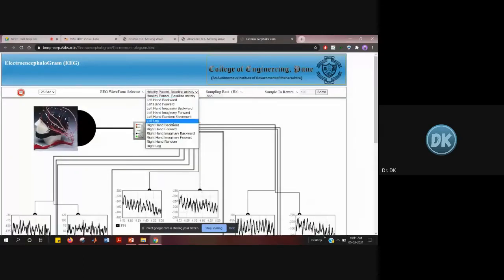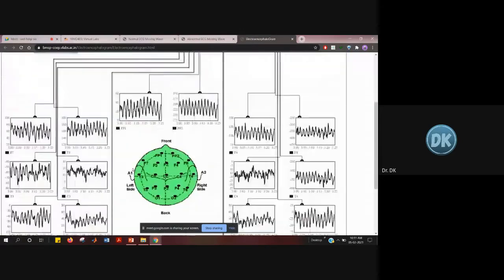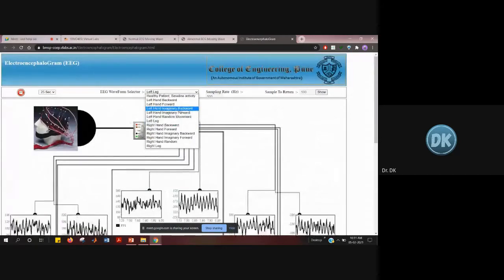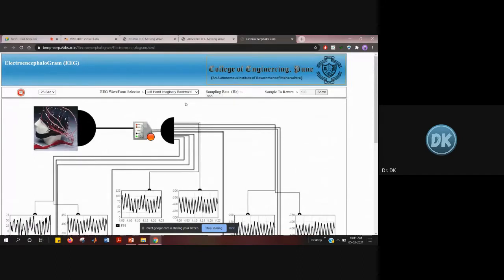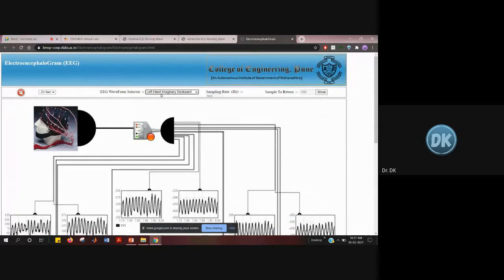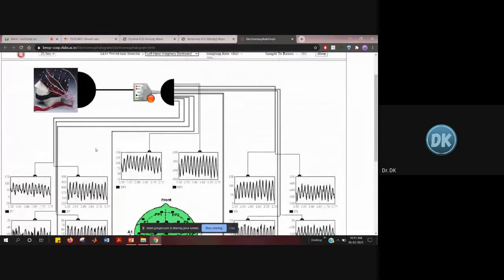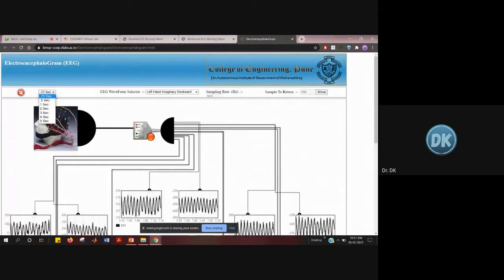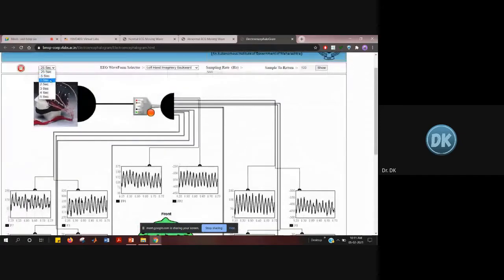If you change it to left leg movement, the brain activity changes and the waveform changes accordingly. There is also something called imaginary movement — the person won't actually be moving but will be asked to imagine hand or leg movement. If you select left hand imaginary backward, the waveform changes again. There is also an option to adjust the time duration — at 0.25 seconds you see the signal displayed this way, and if you change it to one second, you view the signal differently.